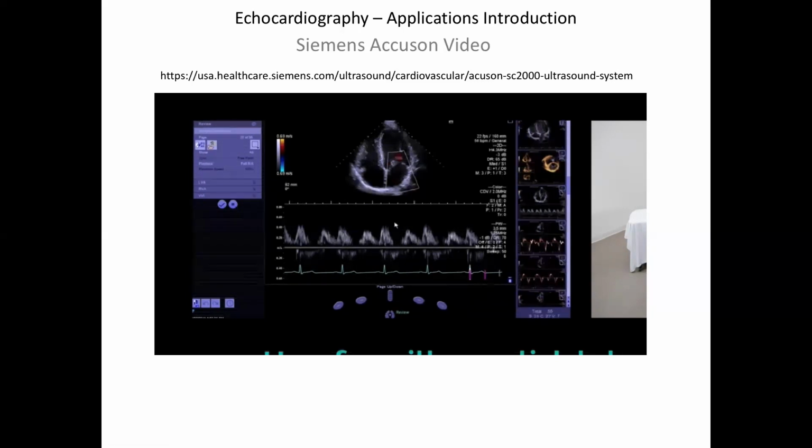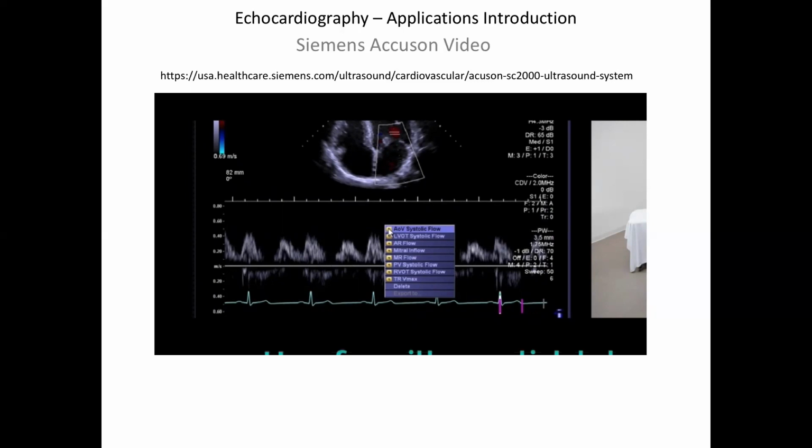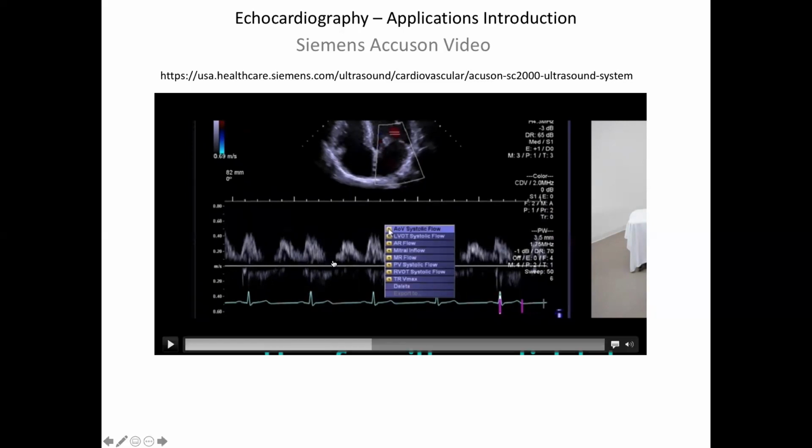And so these velocity pulses here, you can look at the rate of ascent and the rate of decay of the velocity to come up with estimates of the underlying robustness or function, right? Again, most of these computations are now done automatically on the system, given this data, right?